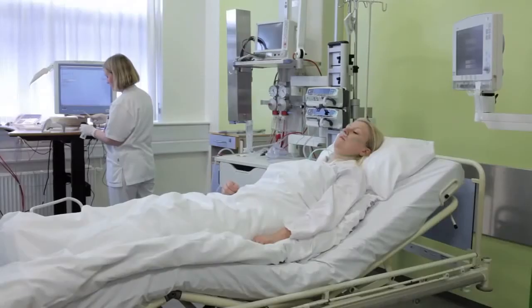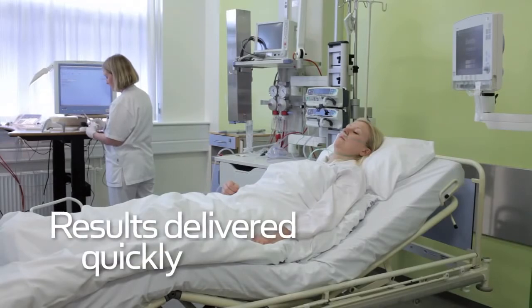Patient results are delivered quickly to where you need them. With First Automatic, you get greater sample integrity, data accuracy, operator safety, workflow efficiencies, and more time for patient care.